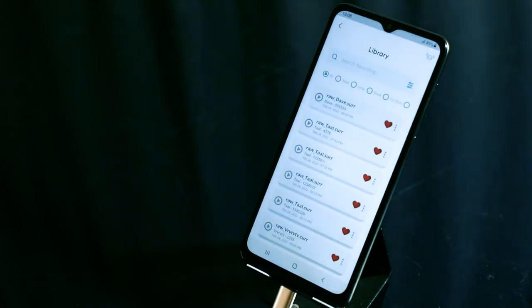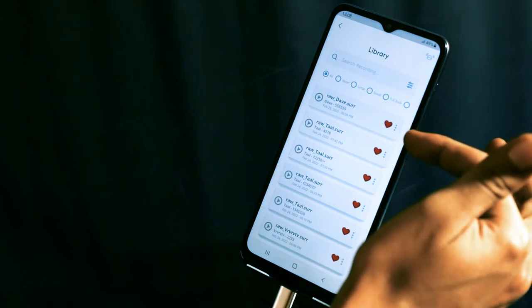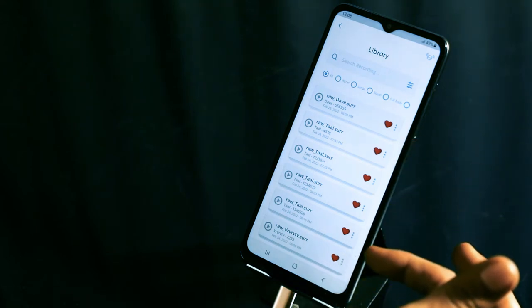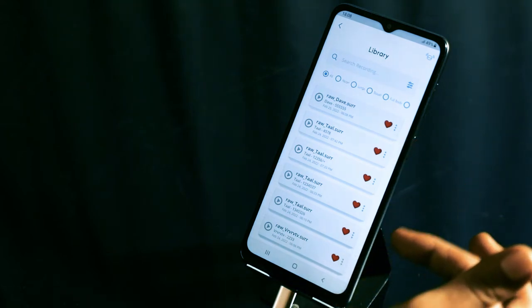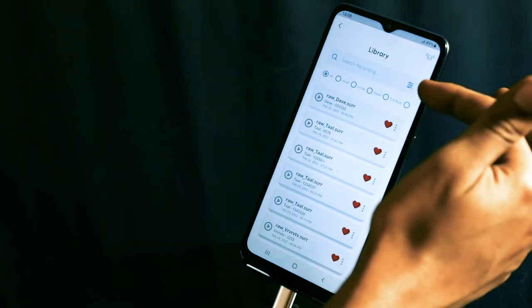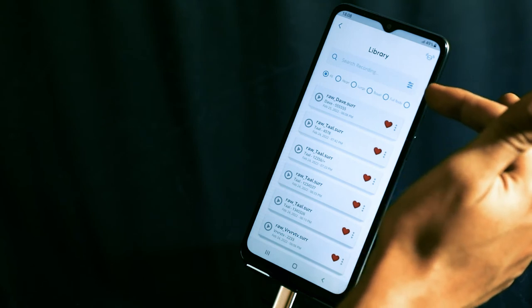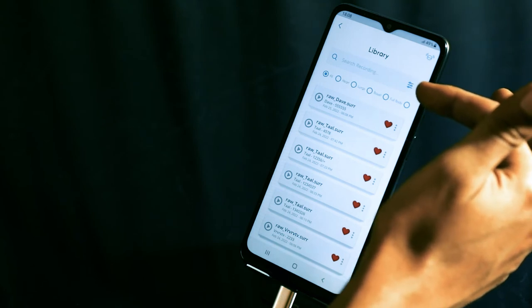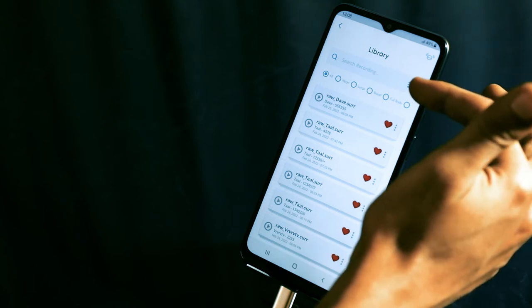Next, you see the library. The library allows you to see all the recordings that have been made. You can also search for any recording via patient name, patient ID, or even phone number.